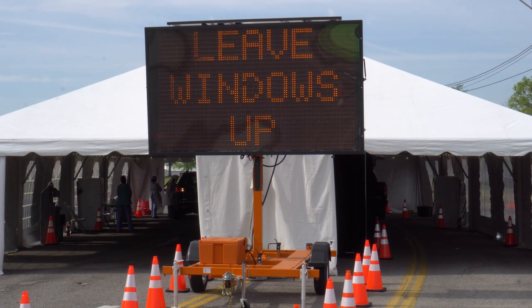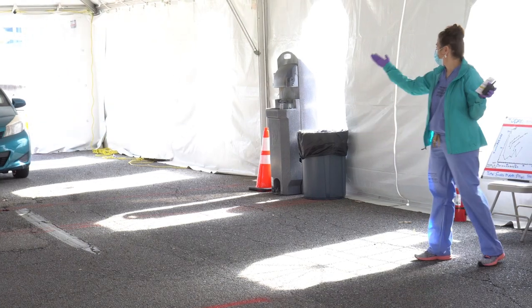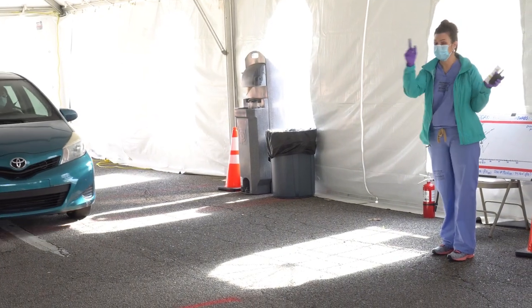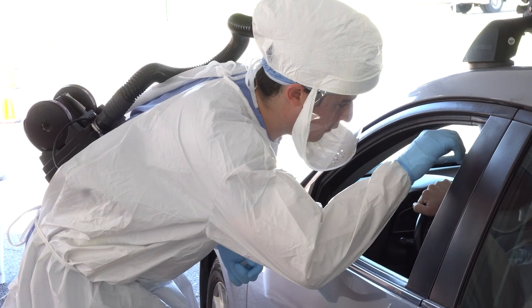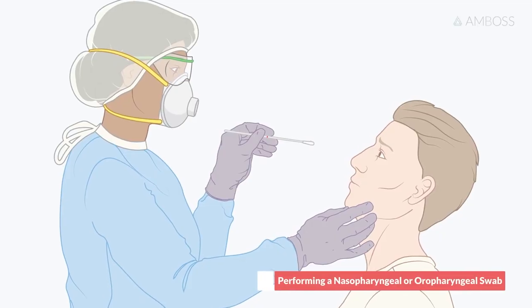Welcome to Tiger Lane, the site at the University of Tennessee Health Science Center's COVID-19 mobile testing site. The purpose of this video is to learn how to take a nasopharyngeal swab.